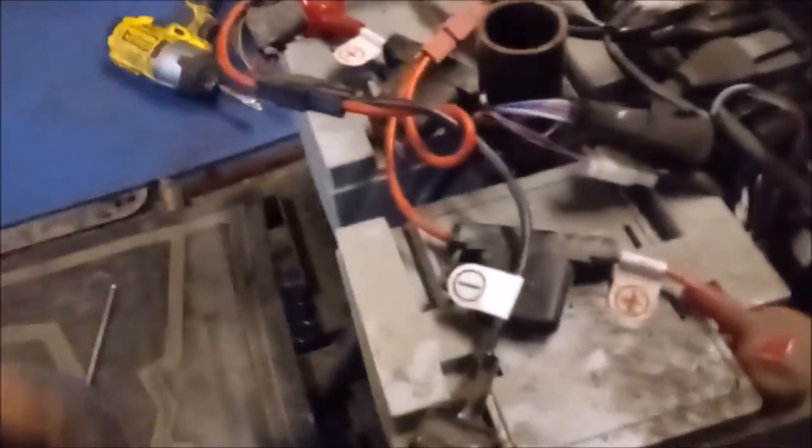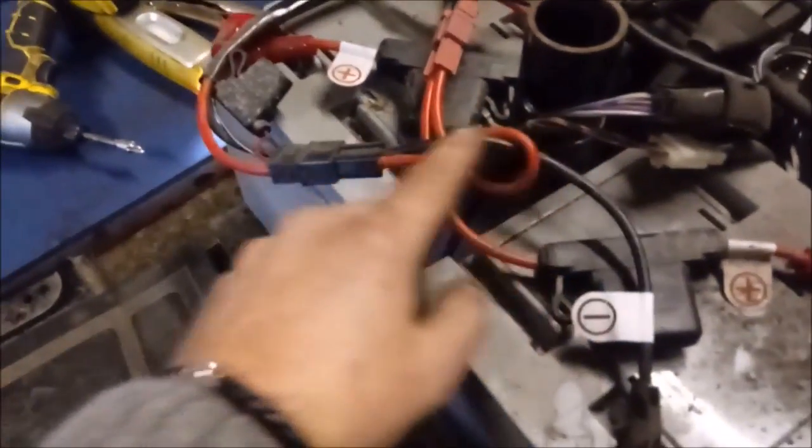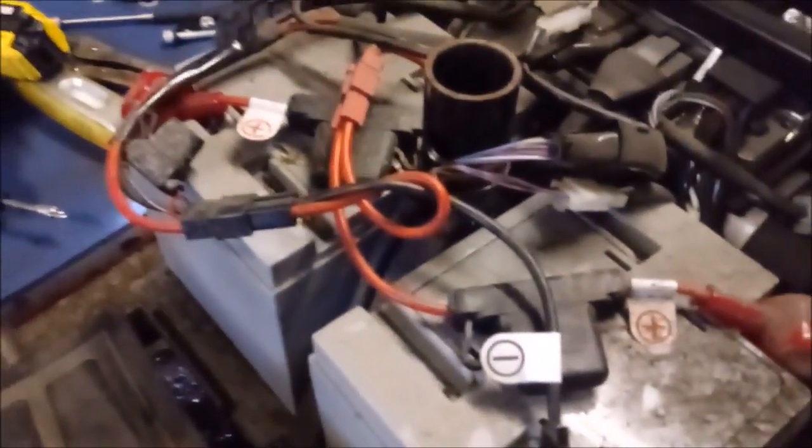Right, so these batteries, I assume they run parallel to each other, but they don't. They run in series. They start off there with a 12-volt feed. That takes you up through one main fuse, up and down to the negative of the second battery, and then from the positive of the second battery it goes through another main fuse up into the main wiring harness of the unit, where it goes to a control box and stuff there, and then obviously the feed comes back. It comes back down this black wire here from the earth point. You've got a reset switch there, and it comes back down to this earth on this battery. So it's 24 volt, two 12 volt batteries in series. Right, let's get them off.